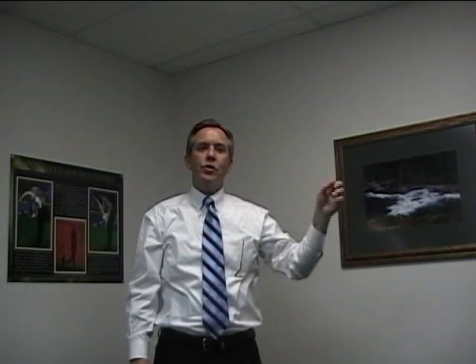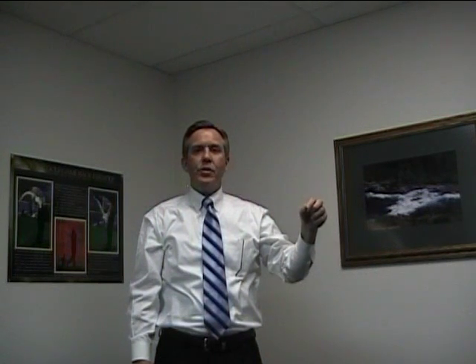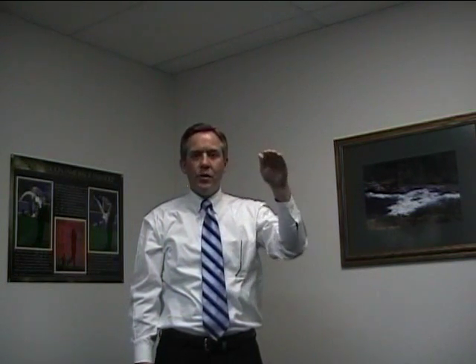We also want them to realize that this is a stretch and a strengthen exercise. We want them to be in an upright, neutral posture. In some ways, they may even be better off to sit with this exercise. So I'm going to show you standing, and then I'm going to show you sitting. They can actually do the sitting if they put the strap in the side of the door and do it that way. Or if they want to stand, then they would put it in the top of their 7-foot door and do it that way.